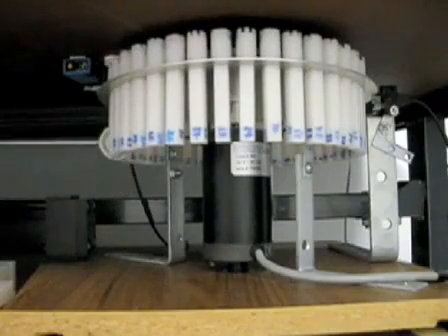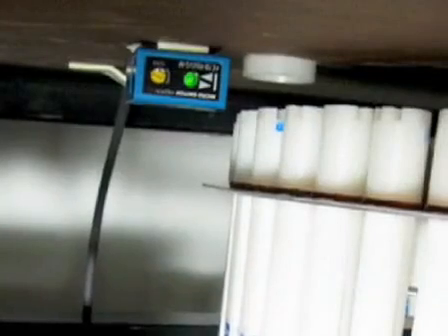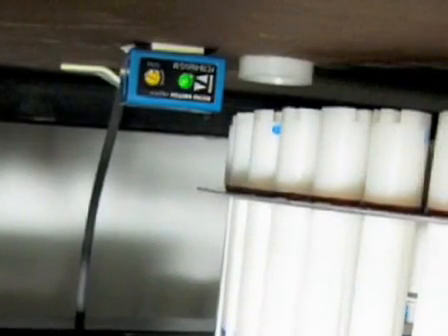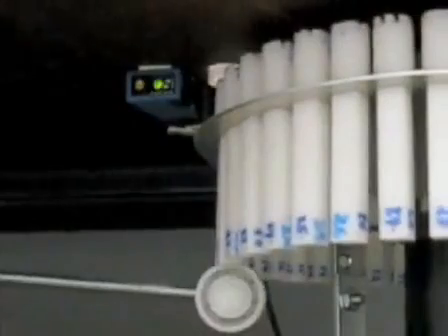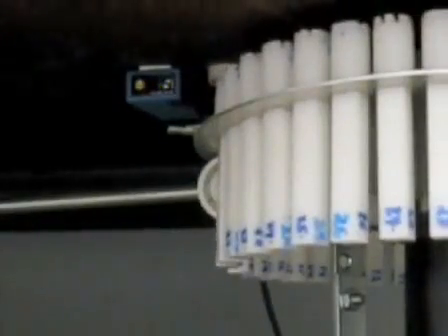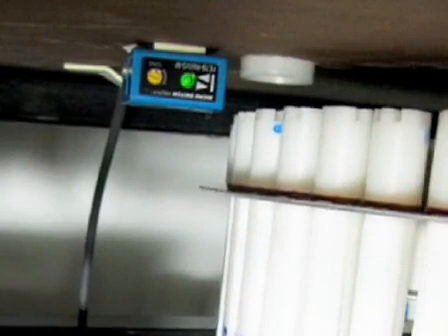The movement of TAPS's components are monitored by several sensors. A retroreflective sensor detects the presence of an elevated stimulus piece. Note the green light going on and off. This sensor is used by TAPS during the initialization of the experiment to properly position the rotating rod at a specified distance below the stimulus pieces.